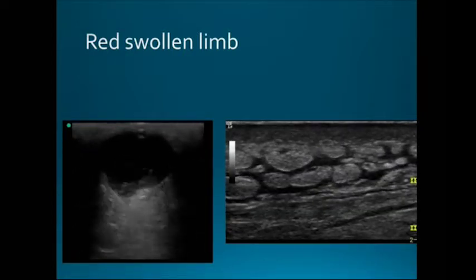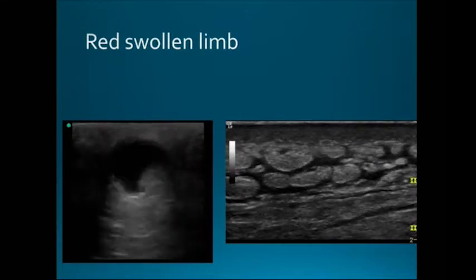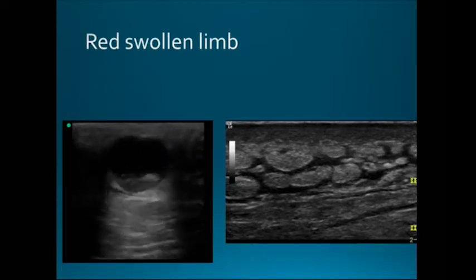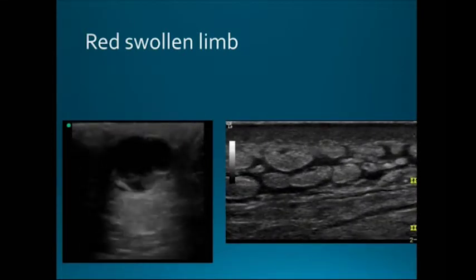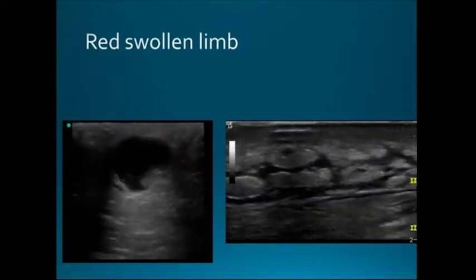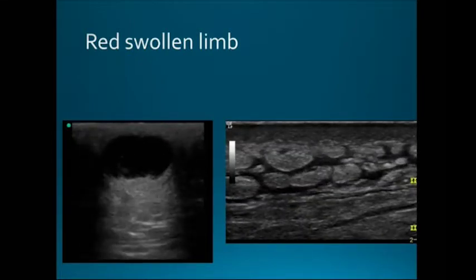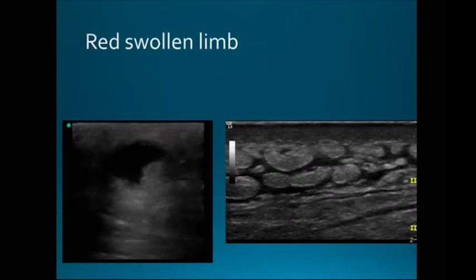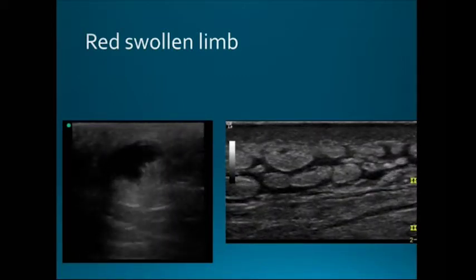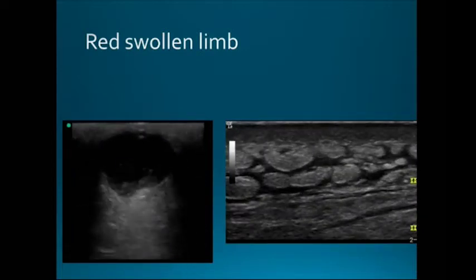And where I like this in clinic is when I'm wondering, do I do just an I&D because there's an area right here in the center that seems to be a little bit more indurated? You can be very confident that they do not have an abscess and just treat them with the antibiotics. That's a very quick, easy thing to do, and also an easy thing to learn with point-of-care ultrasound.